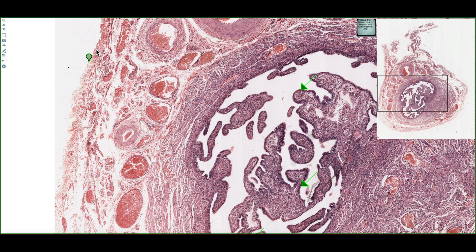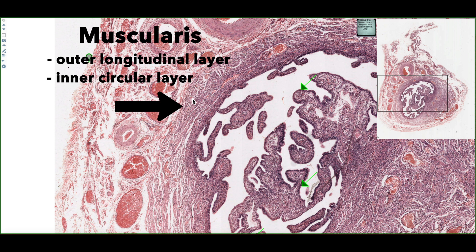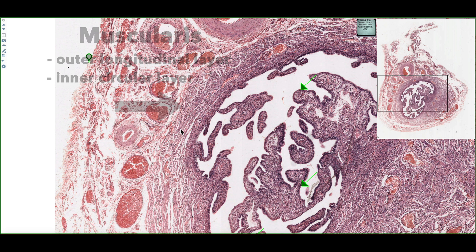Just deep to the serosa, we can see loose connective tissue filled with blood vessels. Just deep to this loose connective tissue, we come to the second major layer — the muscularis. It should be composed of an outer longitudinal layer and an inner circular layer, but in this case it looks rather indistinct as to where the boundaries of these smooth muscle layers are.